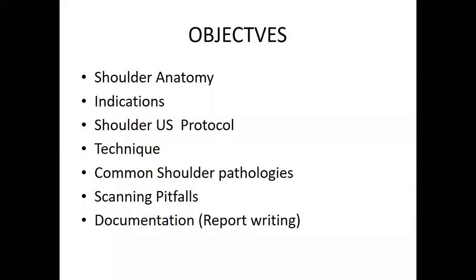Not only that, sometimes you have a patient with shoulder pain who does a plain X-ray, and the X-ray doesn't reveal any pathologies or any abnormalities, whereas ultrasound may help you to assess the soft tissue injury.